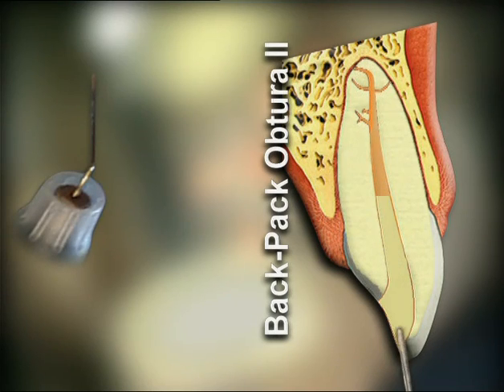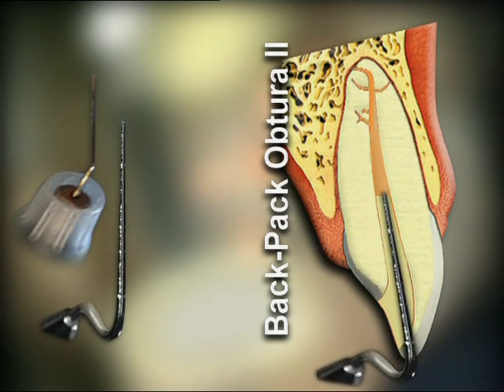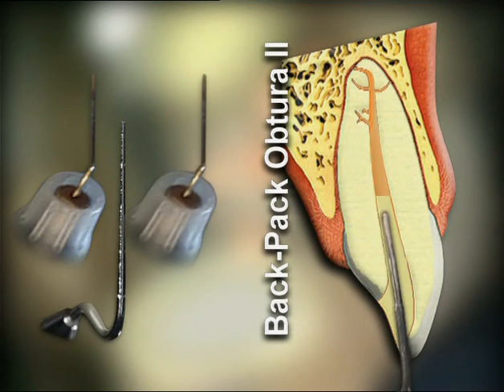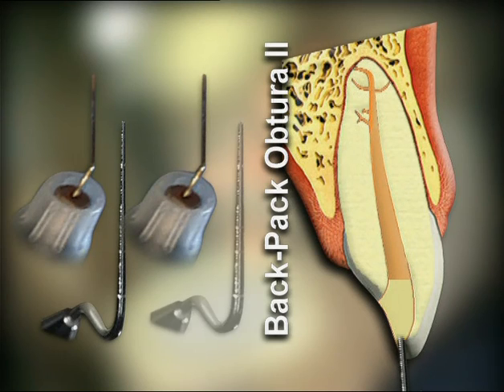Through a series of gutta-percha injections and vertical compactions, the canal is filled completely step by step. The hot tip of the needle will re-soften the most coronal aspect of the apical core of gutta-percha, ensuring cohesion and homogeneity during backpacking procedures.